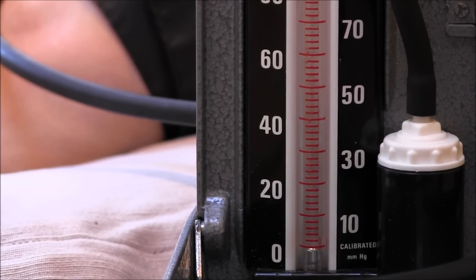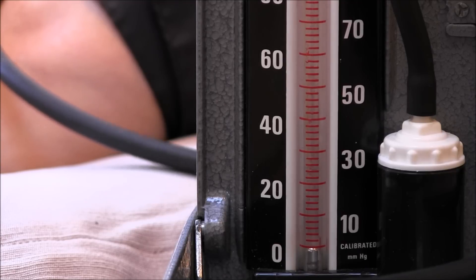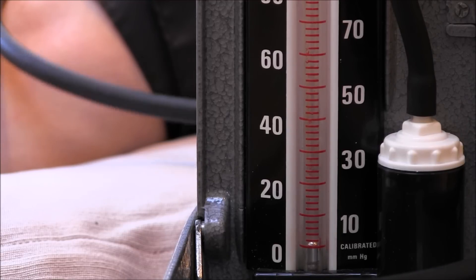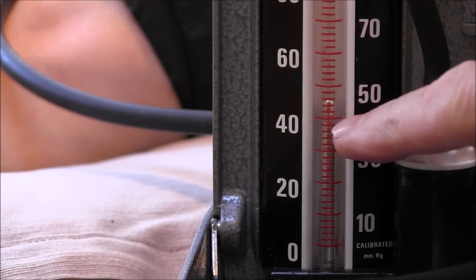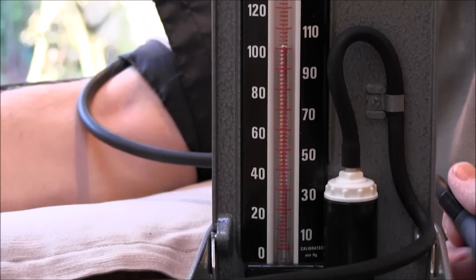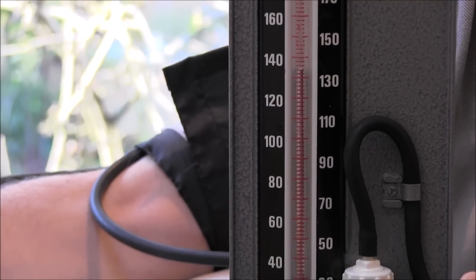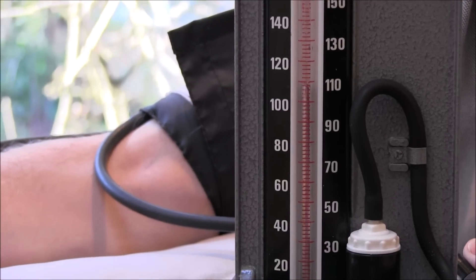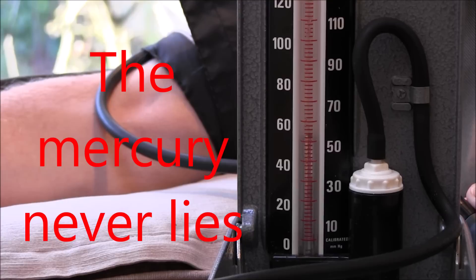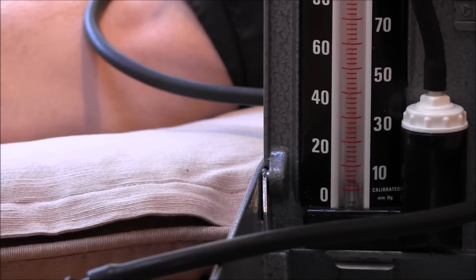The units of blood pressure are millimeters of mercury, because originally blood pressure was measured in just that — millimeters of mercury. In this old-style sphygmomanometer, we've got a reservoir of mercury, and when we pump the mercury up, this reflects the pressure in the cuff around Bill's arm. We can see it — we pump up until we can't hear it, then let it down and listen for the sounds to work out Bill's blood pressure. This is actually the most accurate way to do it, because the specific gravity and density of mercury will never vary.